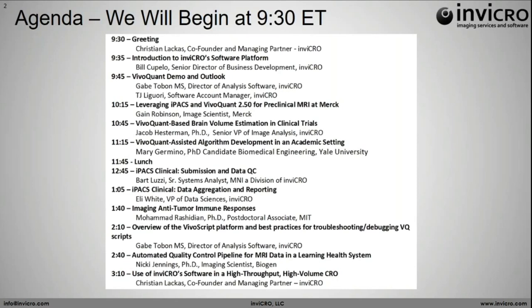use cases for it. It's not limited to a particular IPACS installation. Integration into the larger workflows will be part of the clinical IPACS, but the individual module itself you can use with the discovery.